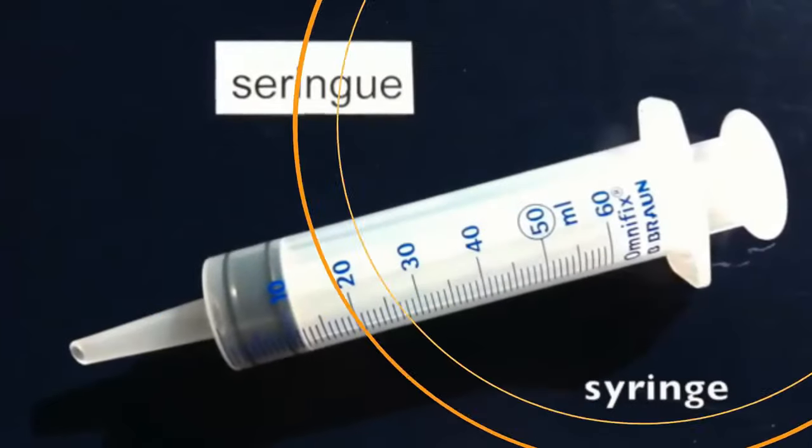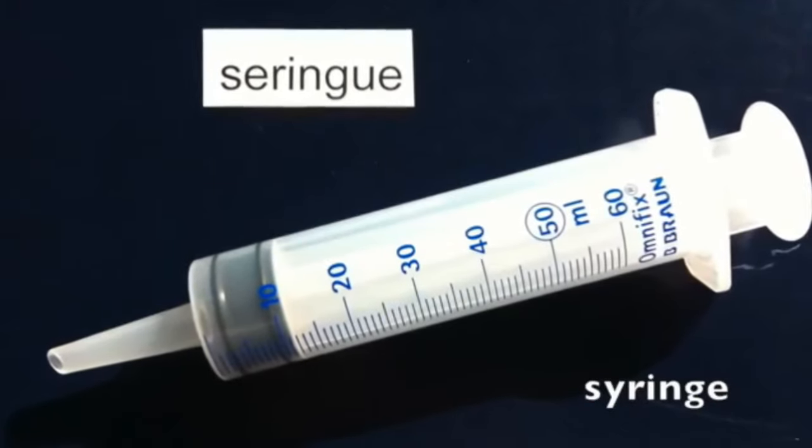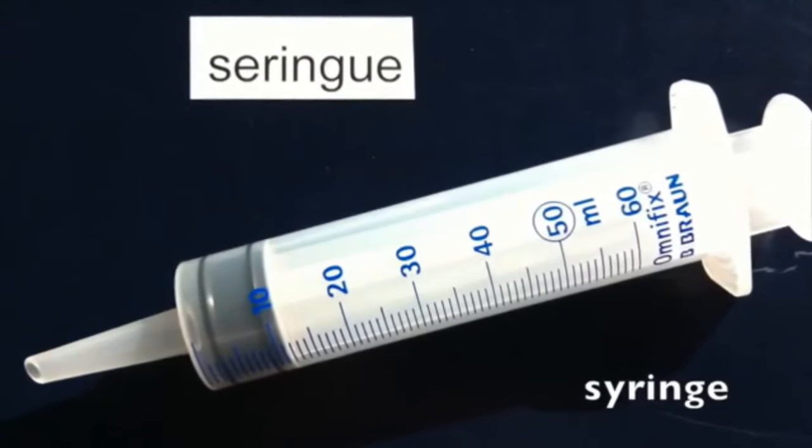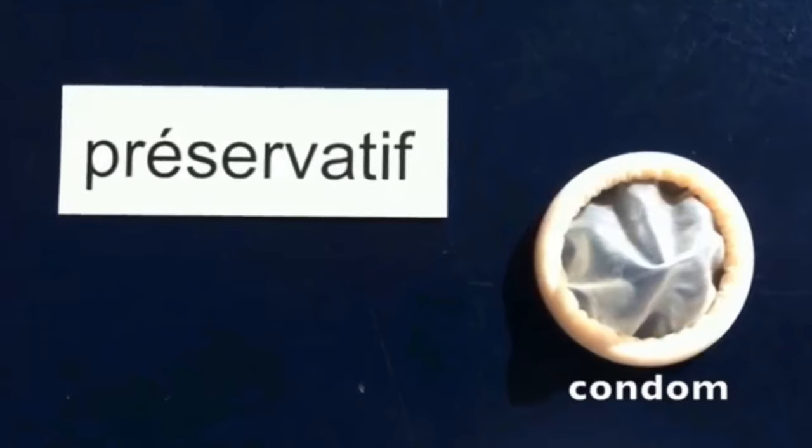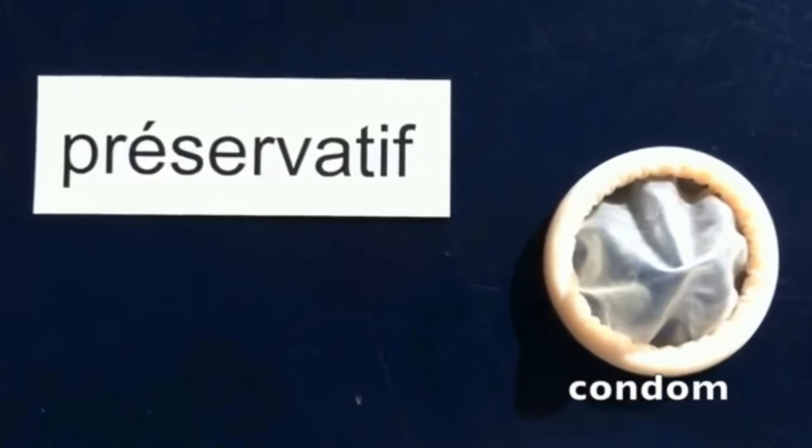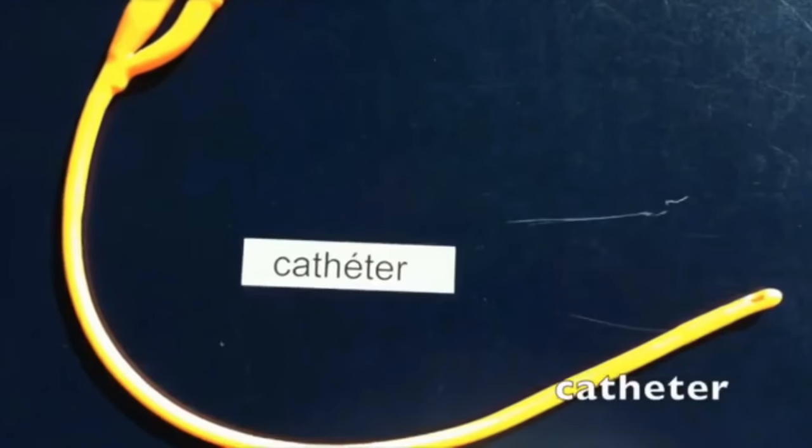We are going to tell you how we make a balloon tamponade. We will first share with you the equipment required for making a balloon tamponade, which should all be sterilized. We need a 50 ml syringe, which you can see here. Secondly, we need a condom, then we need a number 20 Foley's catheter—actually, the thickest Foley's catheter should be number 20.